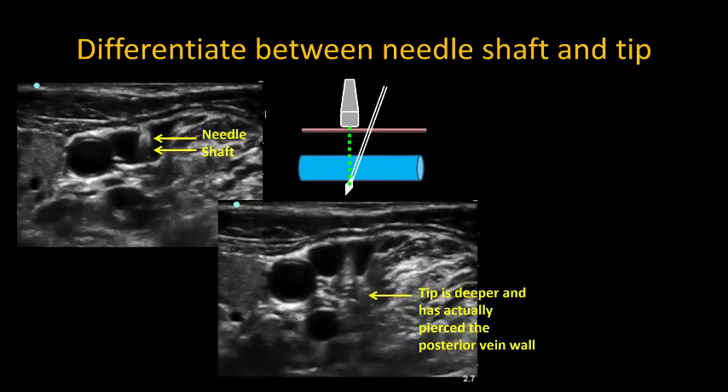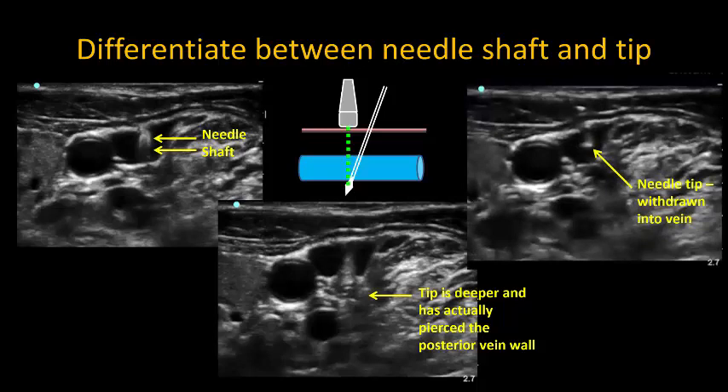Always try and slide the probe to and fro to confirm if the needle is actually deeper than you think. Here, you can see a typical appearance of a needle tip which has been withdrawn into the lumen of the vein, and contrast that with the image of the shaft on the left side of the slide.